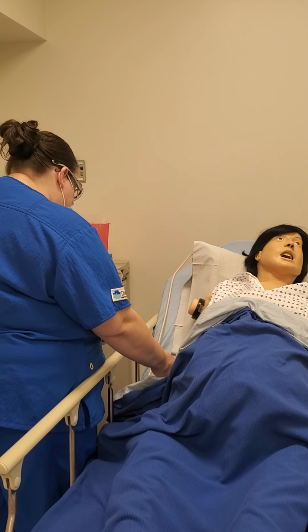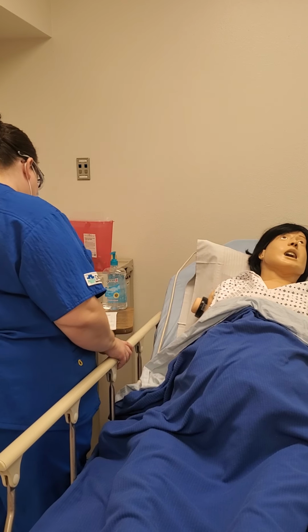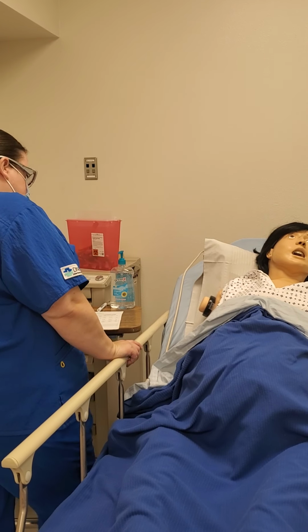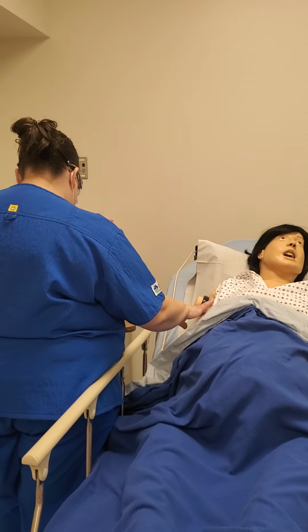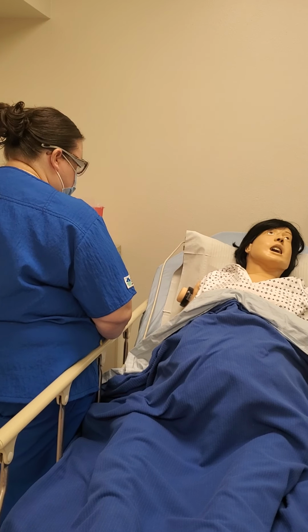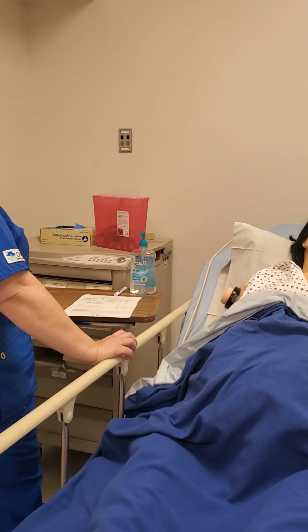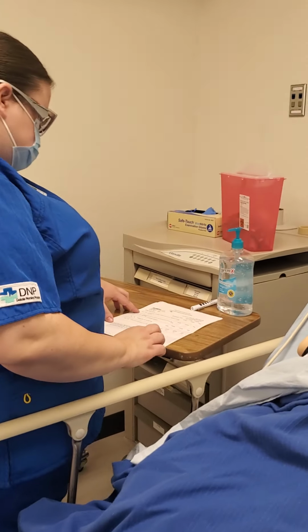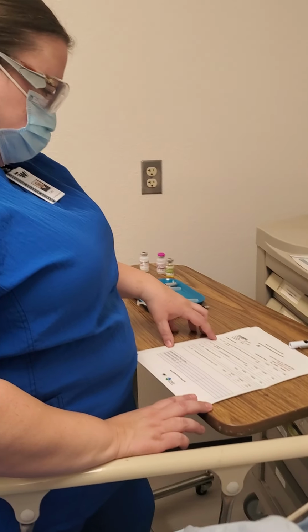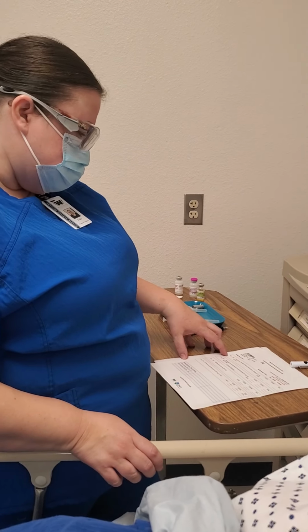And then I have allergies to penicillin and furosemide. And then like I said, I was going to be administering the Phenergan intramuscular Z-Track method in your arm. And I have your Phenergan here. And then I'm also going to be administering tuberculin in your forearm, and that's a TB test.